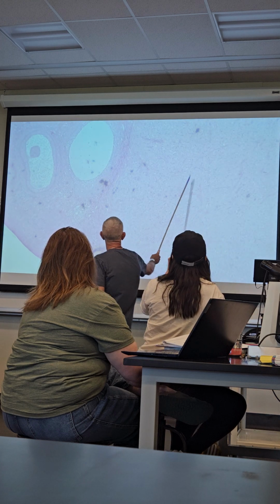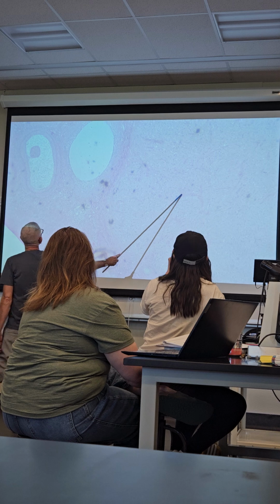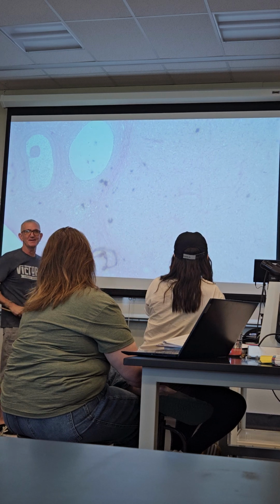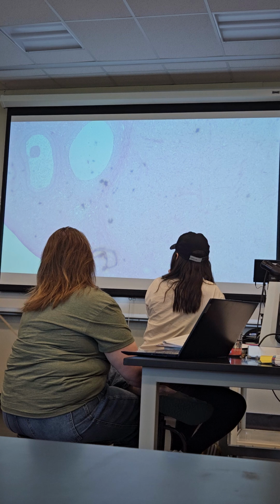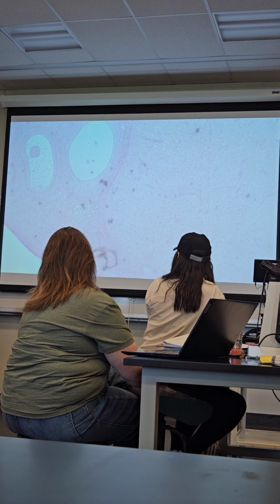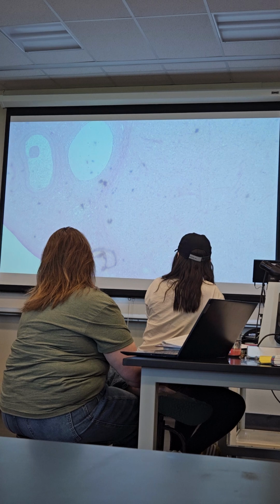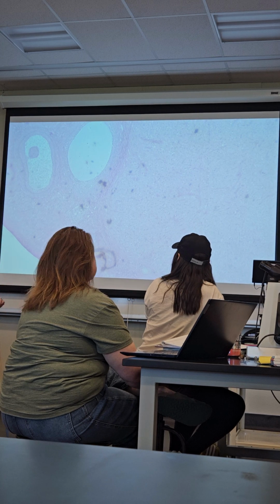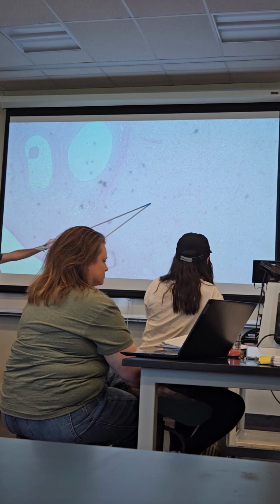What's this? Ovary? You see a big cystic mass with follicles around there. What's the big cystic mass? It's what your Graafian follicle turned into. It's what your tertiary follicle becomes. So that's a corpus luteum.